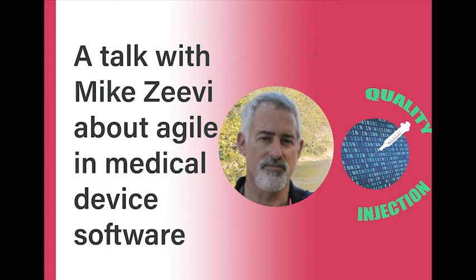So they went ahead, they put together a group of people and sat down over a period, I think, of a year or two, and came up with this guidelines on how to align the way you use Agile within a medical device environment, seeing how it fits into 62304, and they even mention various different, the relationship to the waterfall, to incremental and evolutionary, defining stories. They talk about documentation, traceability.